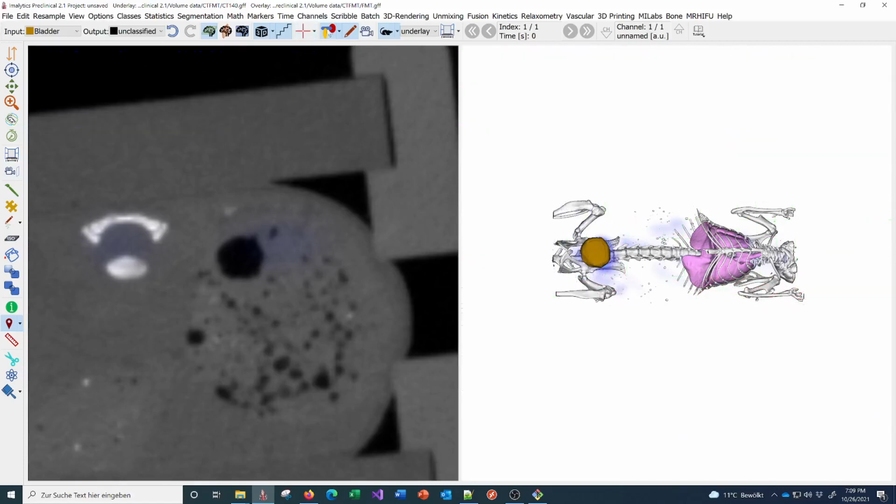Then here, this button toggles the segmentation to show the segmentation or not, and you can also hide individual classes. What that is here, for example, hide the lung or show all again. Then this button here toggles the scribble rendering, how the scribbles are shown. Sometimes you can turn it off accidentally and then you are surprised why they are gone, but they are just hidden.